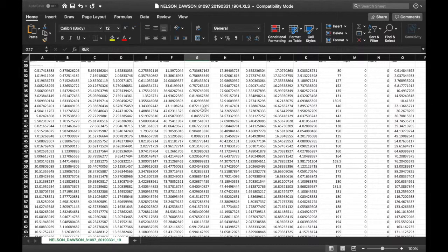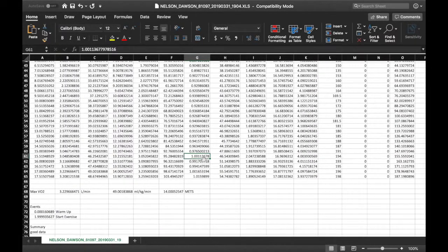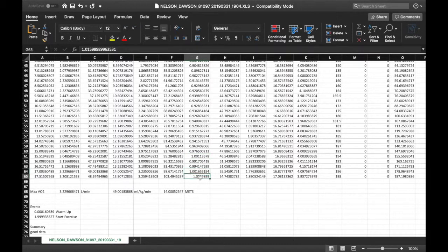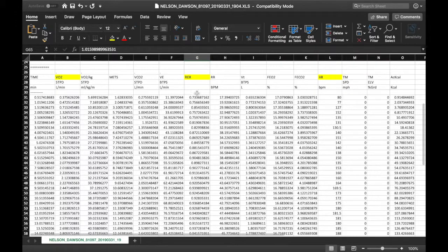Respiratory exchange ratio (RER) looks at how much carbs versus fat your client is using. When you're working out at a lesser intensity, you're using more fat — that's aerobic. But as exercise gets harder and harder, you go more anaerobic and shift to glucose. When you reach an RER of 1.0, you're using all glucose. That's how we know we got Dawson to his max. Ideally you want to look for an RER around 1.1 to 1.15.